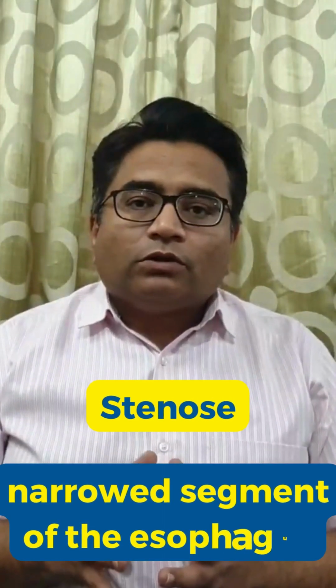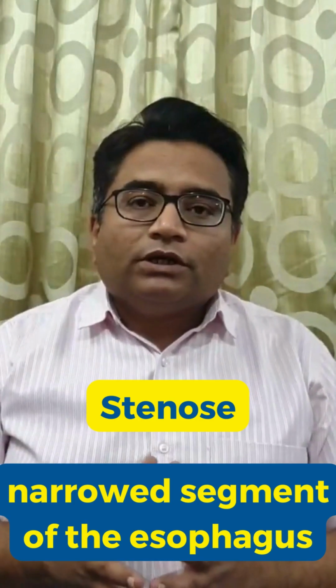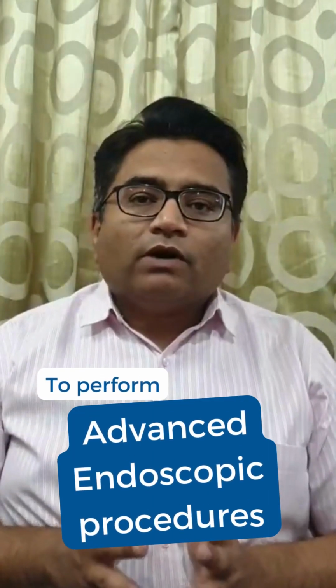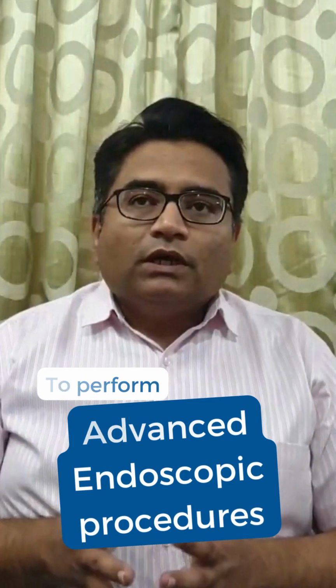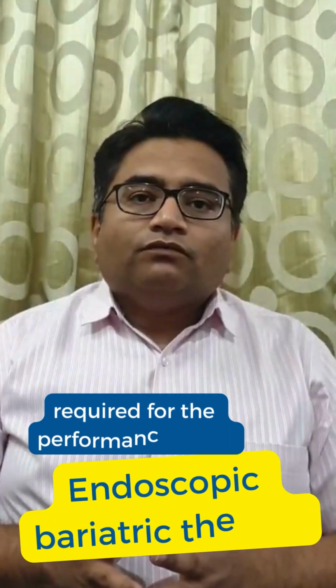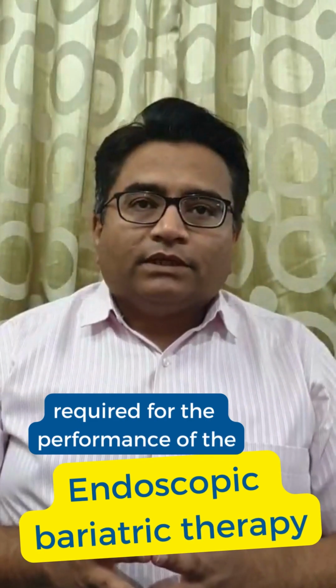Similarly, to dilate a stenosed or narrowed segment of the esophagus or the duodenum, we need to do the gastroscopy. Also, it is required to perform advanced endoscopic procedures of the third space like ESD, POEM, and also required for the performance of the endoscopic bariatric therapies.